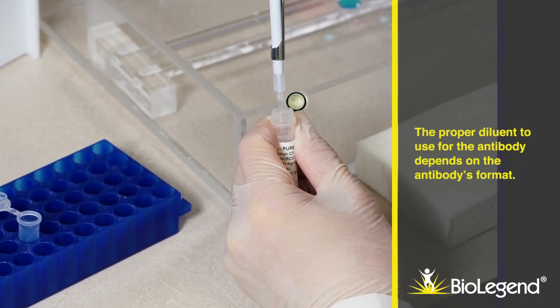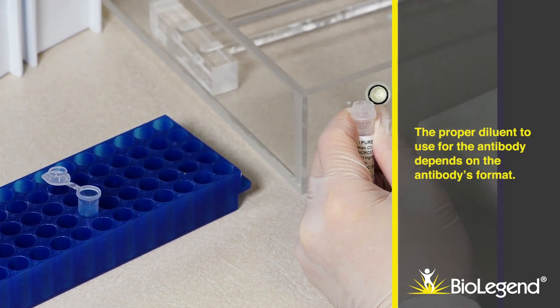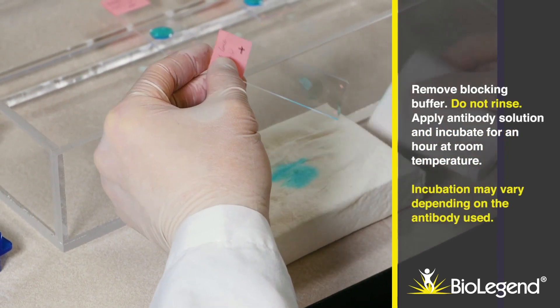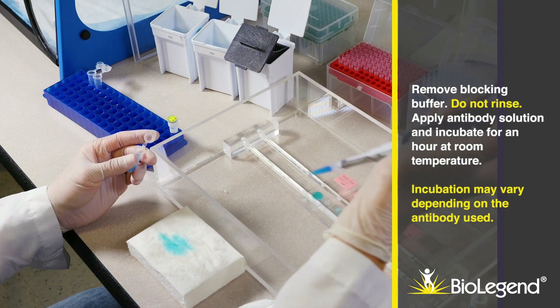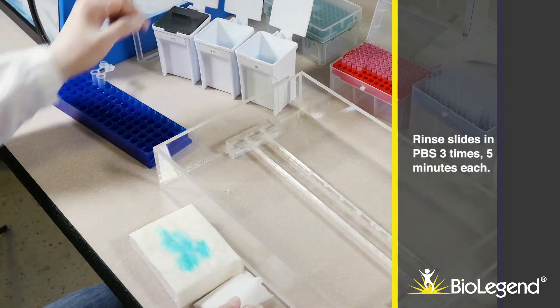The proper diluent to use for the antibody depends on the antibody's format. Remove blocking buffer — do not rinse. Apply antibody solution and incubate for an hour at room temperature. Incubation time may vary depending on the antibody used. Rinse slides in PBS three times, five minutes each.